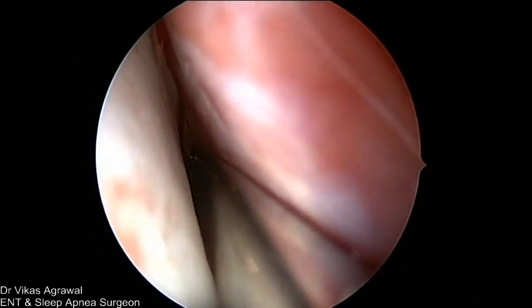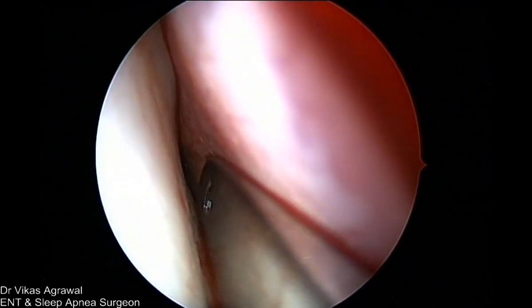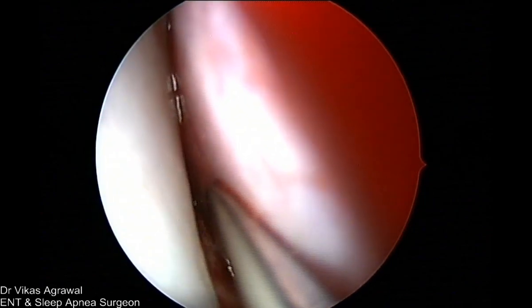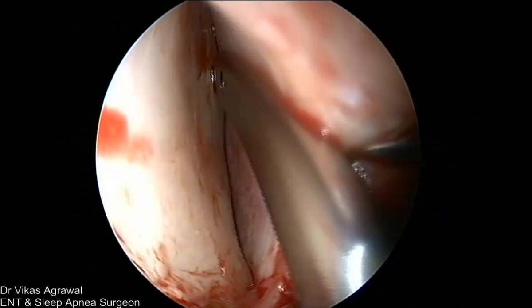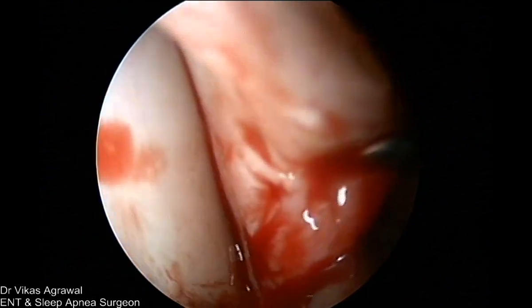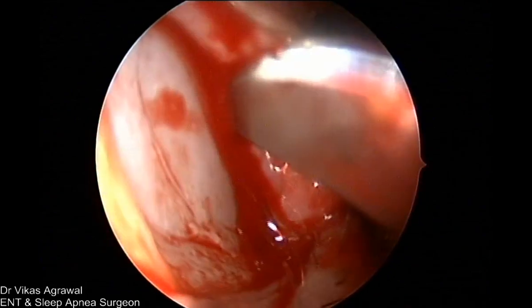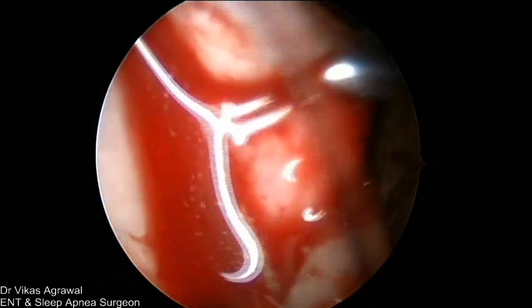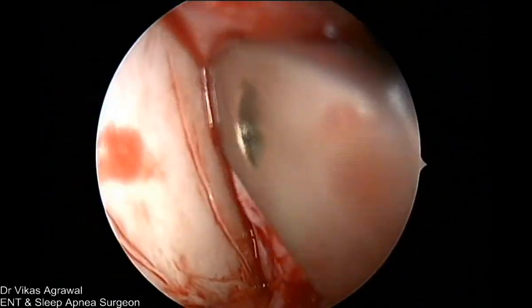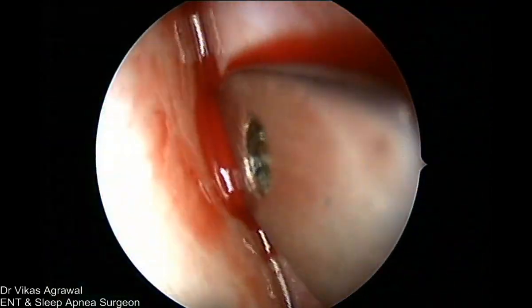I would say that the first requirement for this is a good anesthesia workstation and monitoring system, because these two things are going to give accuracy in anesthesia. A good anesthesia workstation will give complete and perfect ventilation, and the monitoring system includes anesthesia gas monitoring, which measures how much inhalation anesthetic agent is going, and the BIS monitoring system, which tells us about the depth of the anesthesia. These two monitoring systems are really going to help you in fine-tuning the anesthesia, and believe me, these are the equipment which give us a good outcome for the patients.